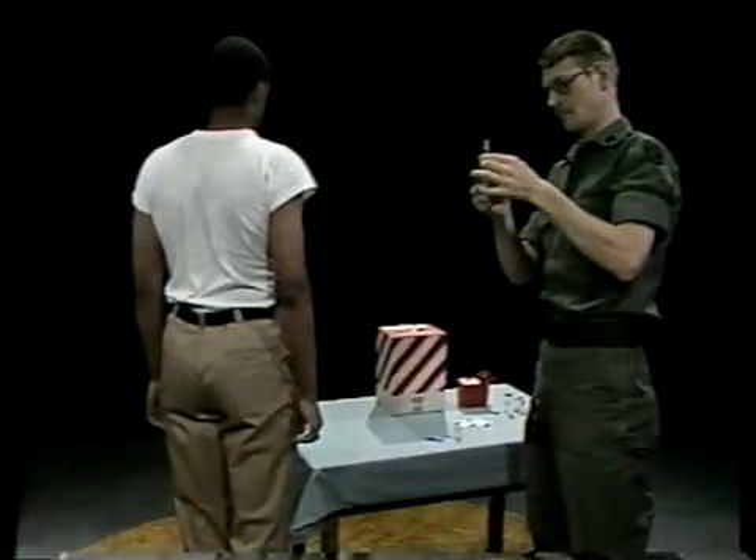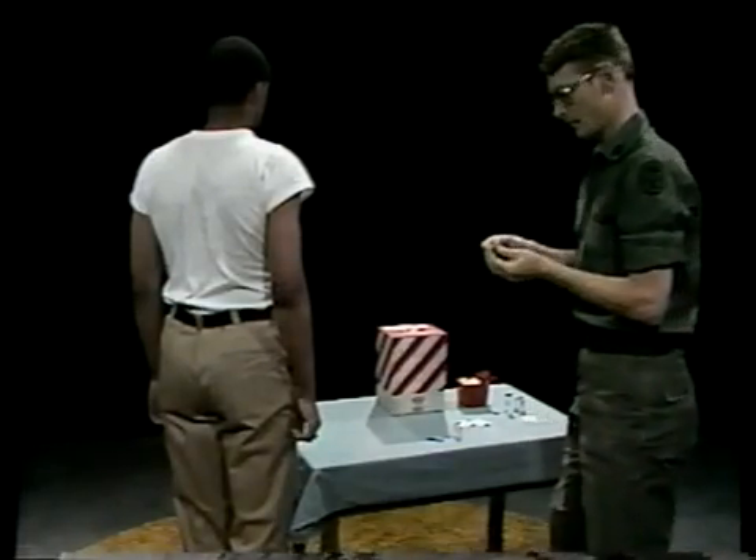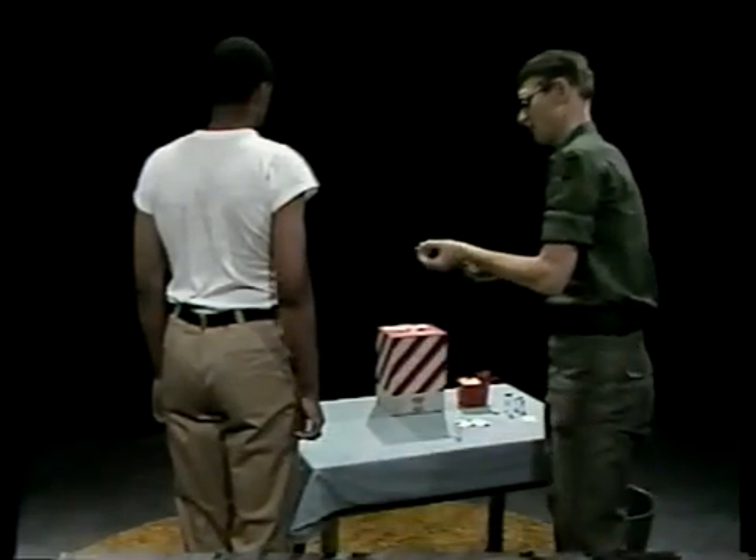After you've washed your hands, assembled, checked, and loaded your equipment, you begin by locating a suitable injection site.